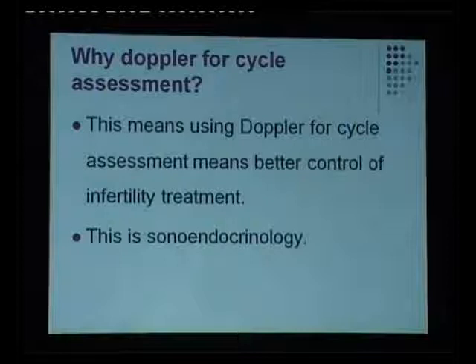That is the reason why all our PCOS patients have a higher flow, and they all have a stromal RI of less than 0.58.